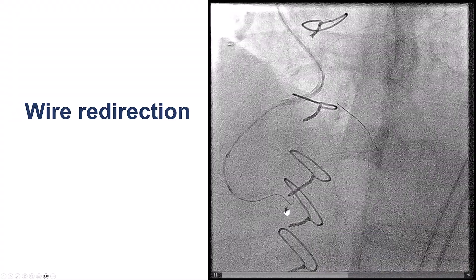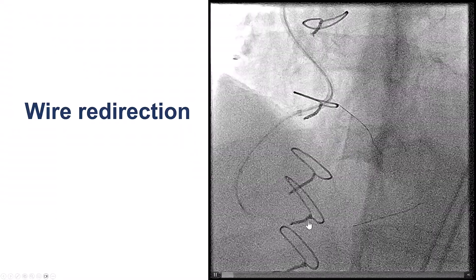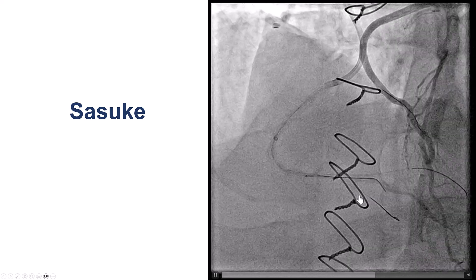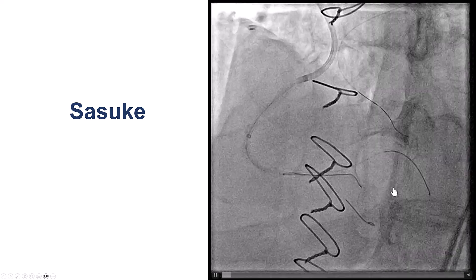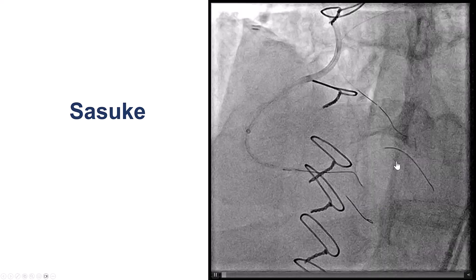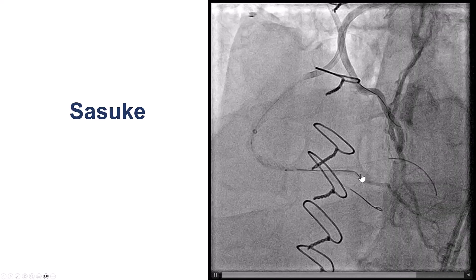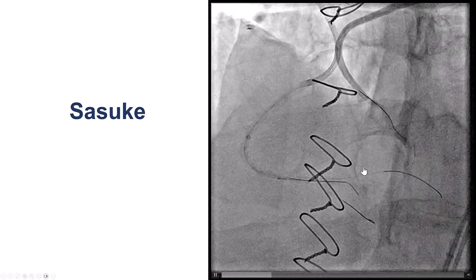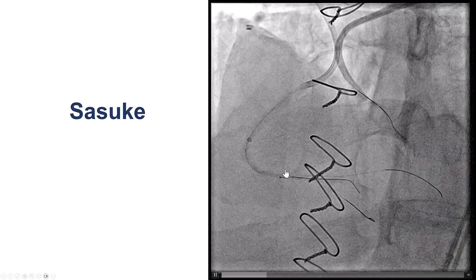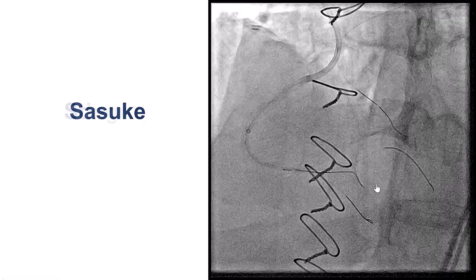We tried different planes and the knuckle went into a location that was essentially a small PDA-like branch proximal to the larger branch filling from the LIMA. We left a wire into that branch, which we assumed was the posterolateral. With contrast injection, we started to see some filling in that branch. We were able to advance a polymer wire next to the origin of the PDA using a dual-lumen microcatheter.